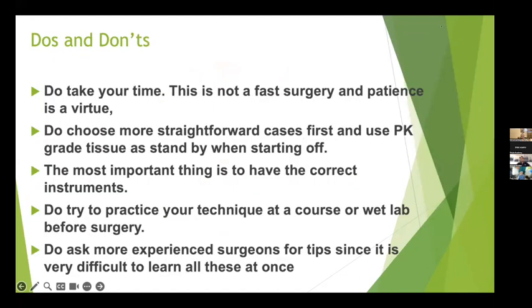So just to summarize, these last two slides are what to do and what not to do if you're starting as a DALK surgeon. Do take your time. This is not meant to be a fast surgery. Allocate extra time and be patient. Choose more straightforward cases. Avoid cases with significant scarring or previous hydrops if you want to achieve DALK. Choose the correct instruments that suit your technique. Practice your technique through wet lab or go with another surgeon to watch them, and always ask more experienced surgeons for tips if you have a difficult case.